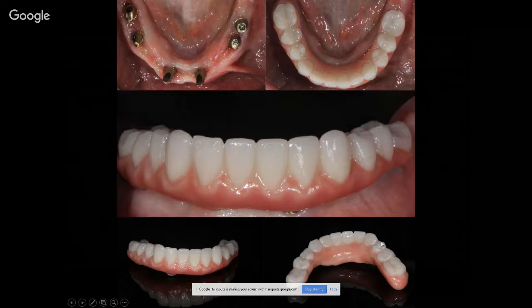I think it's very important for the final prosthesis, and I think it's very important to keep patients in a PMMA temporary for at least 4 to 6 weeks to double check and make sure that they're happy chewing, and parafunctional habits, etc., are all worked out before you go into the zirconia. I highly recommend whenever you do zirconia that patients sleep with a night guard at night to protect the zirconia. This patient will be easily restored by the restorative dentist because I don't think we're going to make many adjustments.